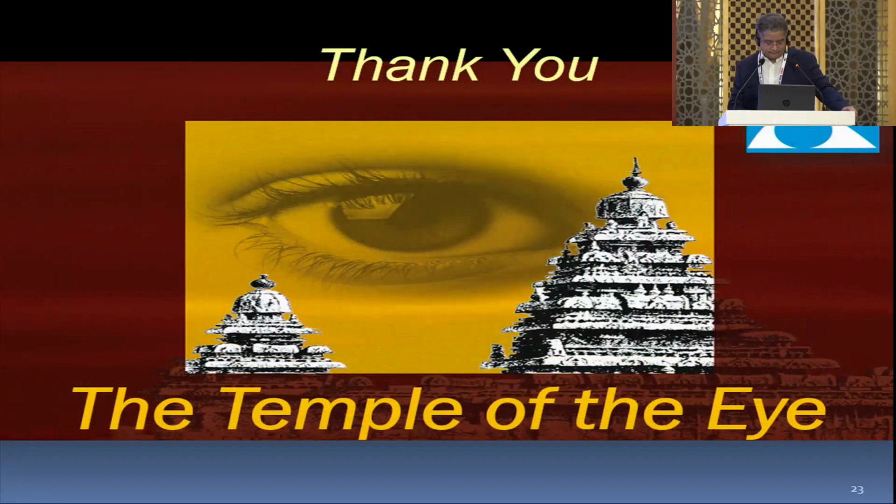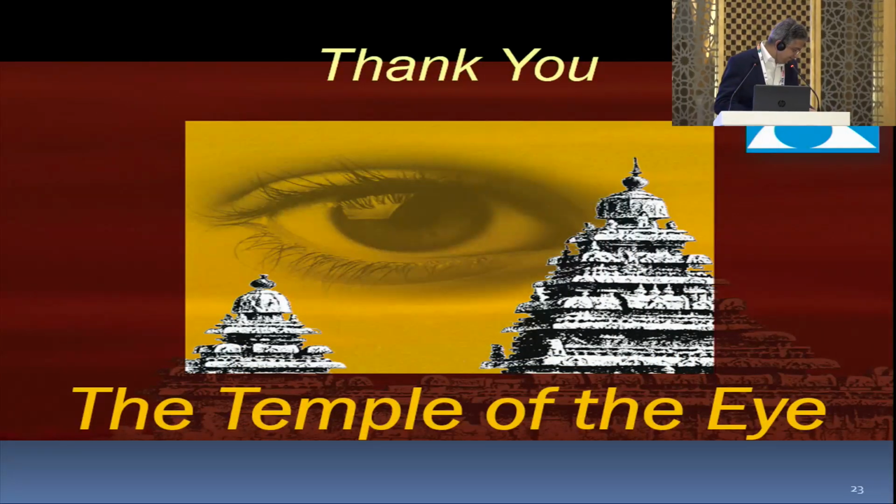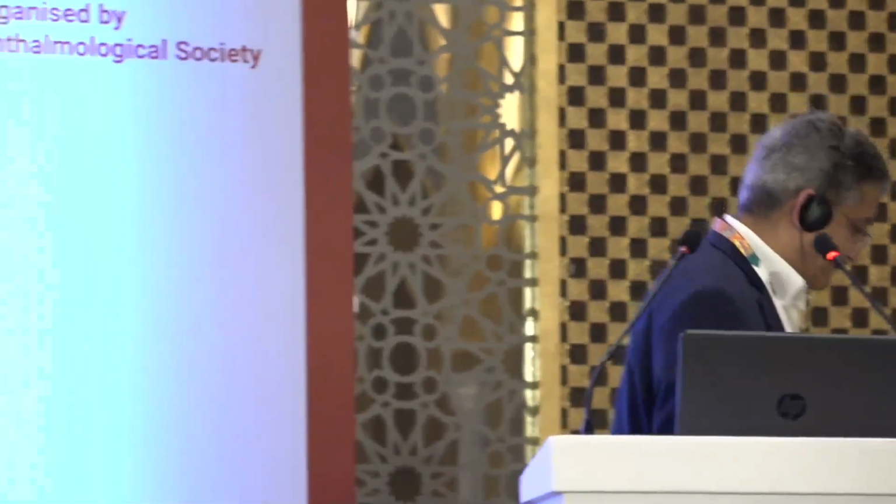Thank you, Dr. Girish. Nice presentation. So, whatever he was telling highlighted the most important step in buckle: drainage, external drainage, and the first thing, accurate localization of all the breaks.